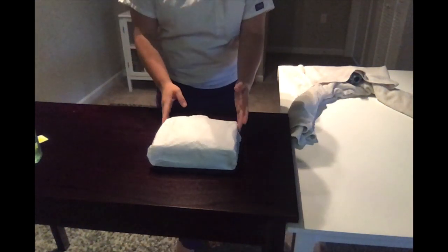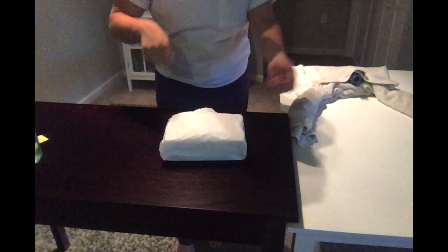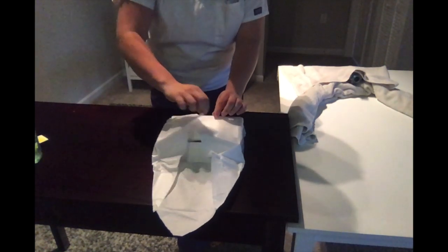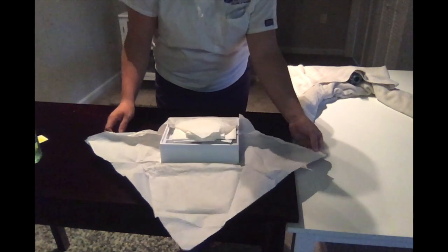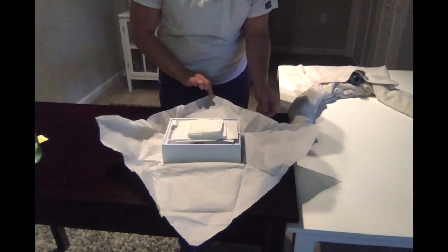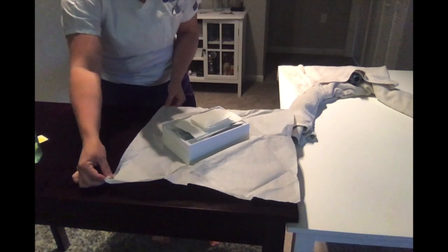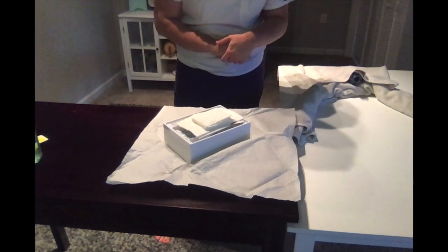So how I want to open this, I want to make sure this flap right here is facing me. And the way I'm going to open it is away, side, towards me. So I'm going to go away first, make sure that I don't cross over it. And then I'm going to go to the side. And then to this side, making sure that I leave a 1-inch border that I can touch around. And then I'm going to take this and go towards me. And then I can go ahead and turn it if I need to, only touching the 1-inch border around to maintain sterility.